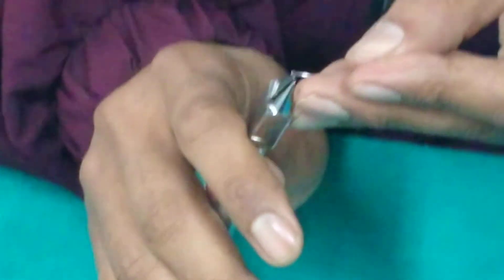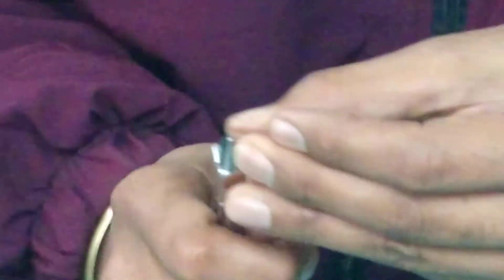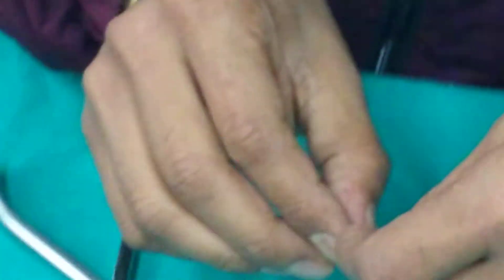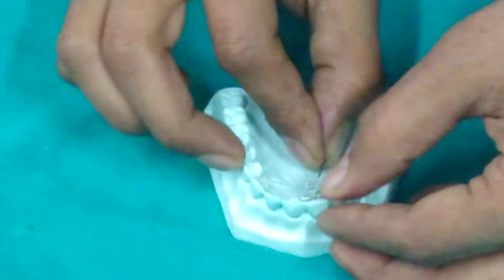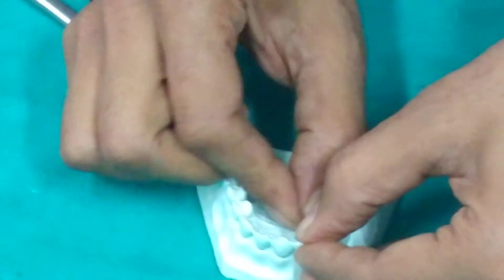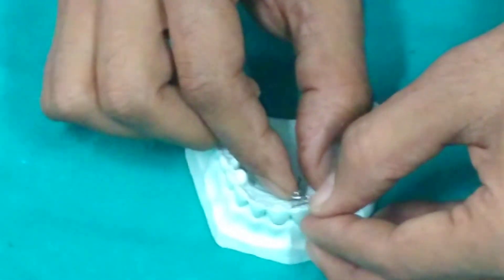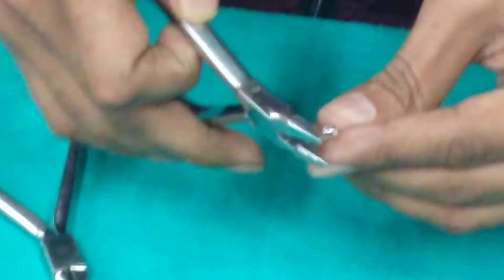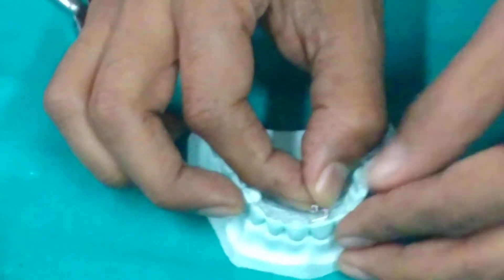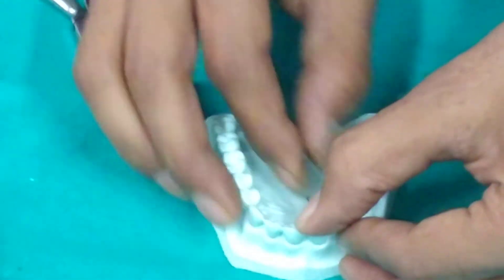A Z spring consists of two helices: the first helix is distal to the intended tooth movement and the second helix is mesial. The Z spring is at 90 degrees to the long axis of the tooth. We need to give a bend to both the retentive arm and the active spring portion.